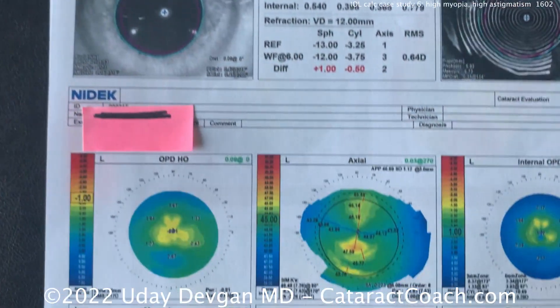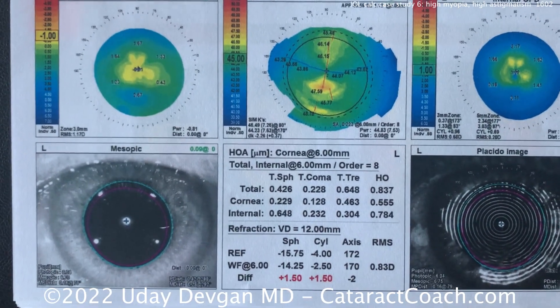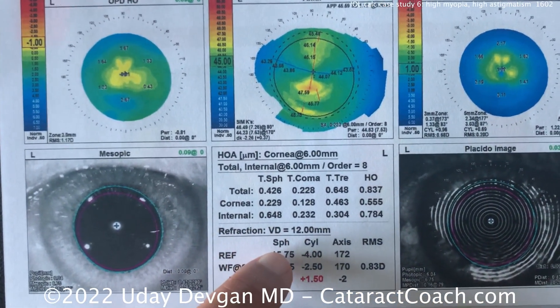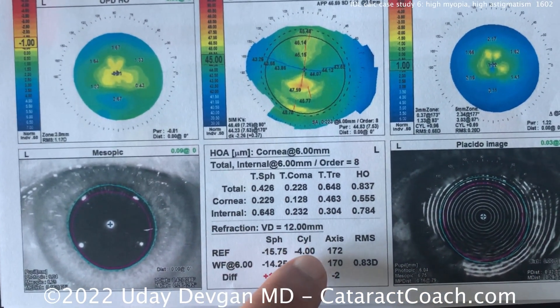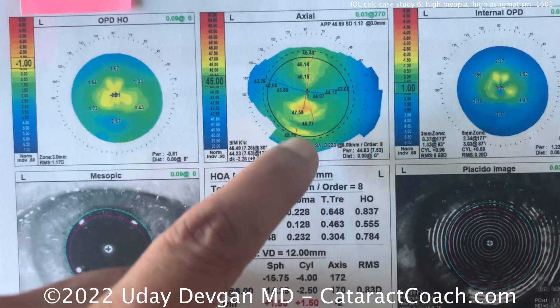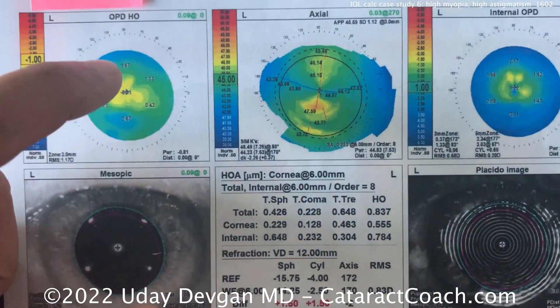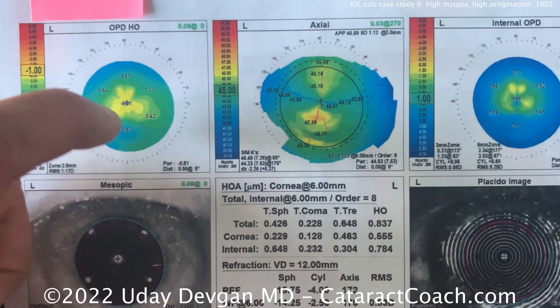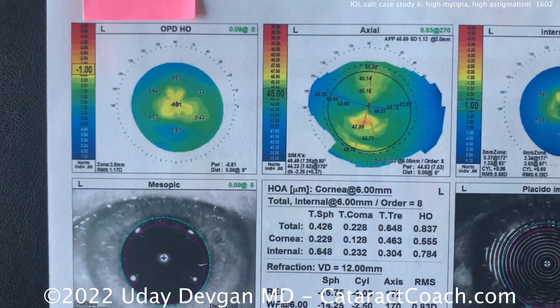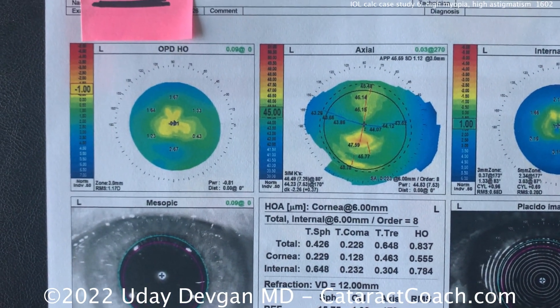Let's look at the other eye — the left eye, even more myopic: minus 15.75, minus 4 diopters of cylinder. The topography shows only about 2 diopters. But what do you notice over here? Why does it have a yellow spot in the middle?